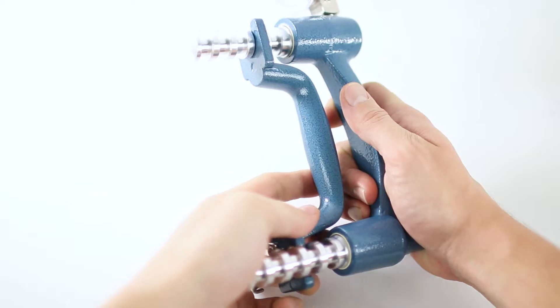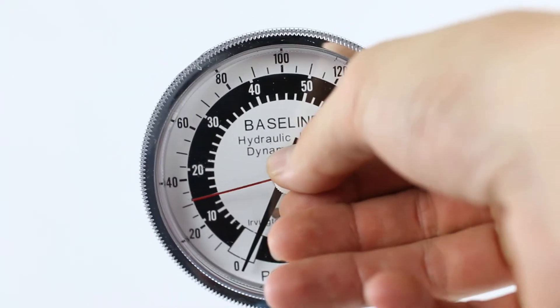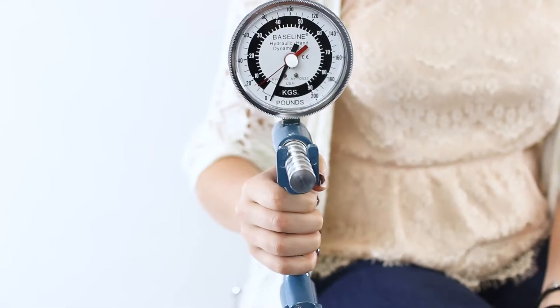To use, set the handle to a comfortable grip position for the patient. Reset the max indicator to zero. Make sure the patient's hand is to his or her side, elbow is at a 90 degree angle, and head faces the clinician.